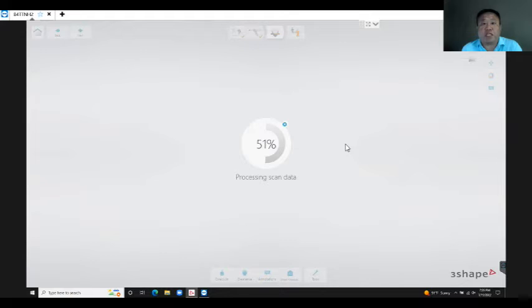They're trying to develop it and fix the zoom. Since we're scanning tissue, when you zoom in, the software struggles identifying the area you want to scan. Remember, the tissue always looks the same, and when you zoom in, it's not clear for the software to identify since it all looks the same.